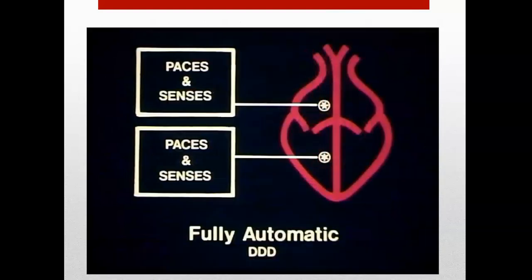So fully automatic mode is DDD. So both the atria and the ventricle are paced and sensed. Both trigger and inhibited responses are activated. If no intrinsic beat is sensed, then the chamber is paced. I'm getting tongue-tied.